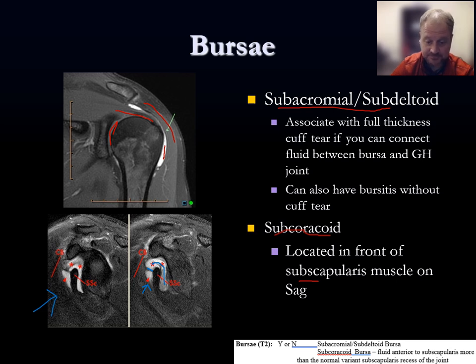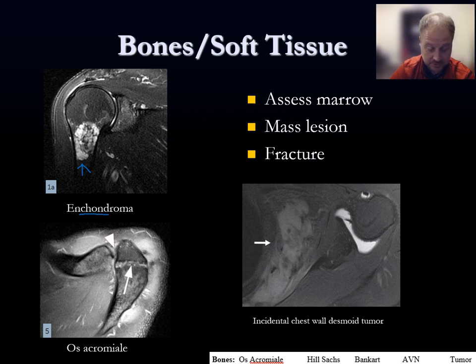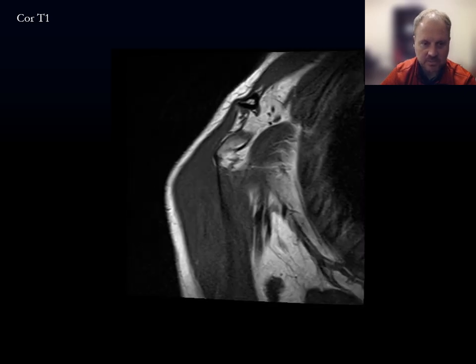Near the end of the study, do a run-through of bones and soft tissues on fluid-sensitive images to make sure nothing has been missed. Look for anatomic variants, bone lesions — such as an enchondroma with T2 hyperintensity, or an os acromiale with its synchondrosis — and incidental findings like chest wall lesions. Always look at the edges of the images for masses, fractures, and marrow signal abnormalities. Using the reading pattern checklist should allow you to hit the ground running in the bone room on shoulder MRI.